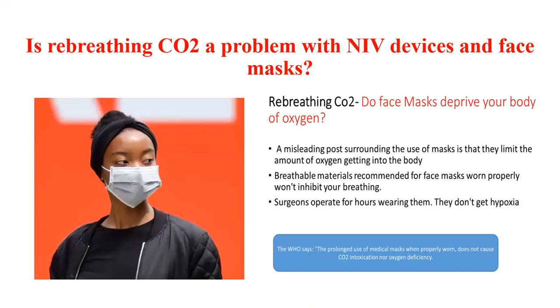The time of wearing an oxygen mask. Is rebreathing CO2 a problem with an oxygen facial mask? The answer is no. Prolonged use of a medical mask, when properly worn, does not cause CO2 intoxication or oxygen deficiency.